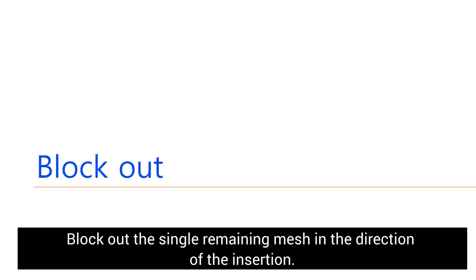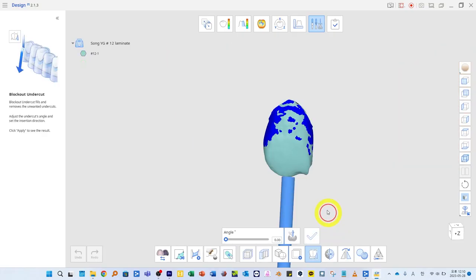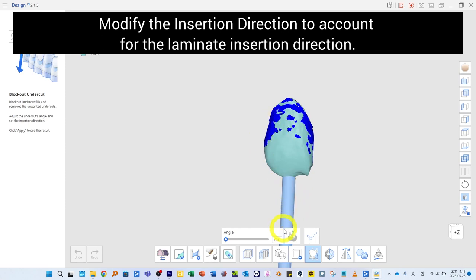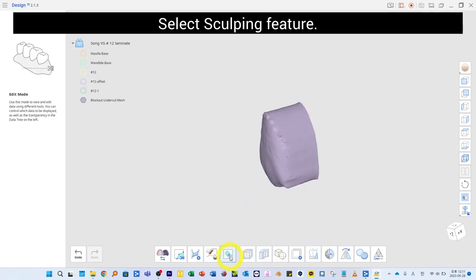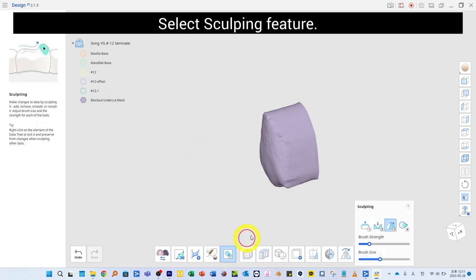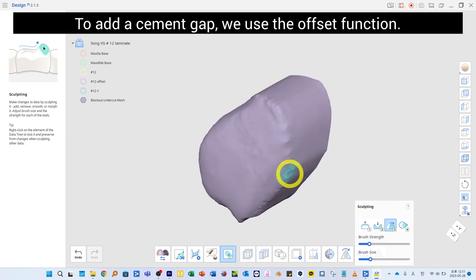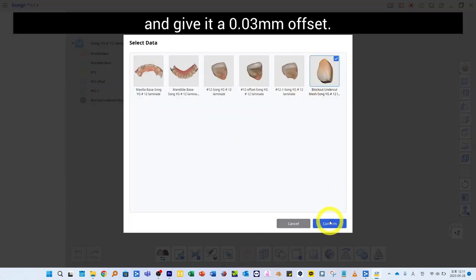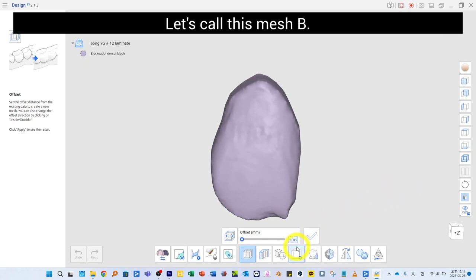Block out the remaining mesh in the direction of insertion. Select the Block Out feature, select the second duplicated mesh, and modify the insertion direction to account for the laminate insertion direction. Press Done to generate the mesh. Select the Sculpting feature and smooth out sharp edges with the Smoothing feature. To add a cement gap, use the Offset function: select the blocked-out mesh and give it a 0.03 millimeter offset. Call this mesh B.